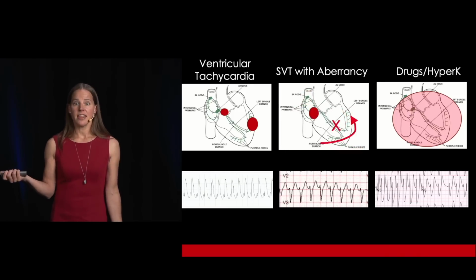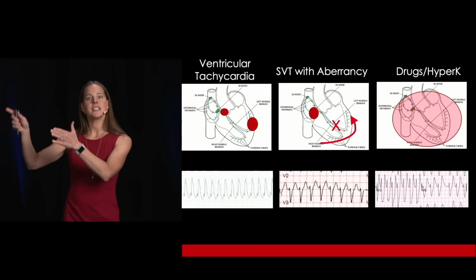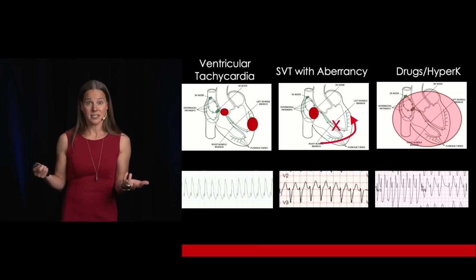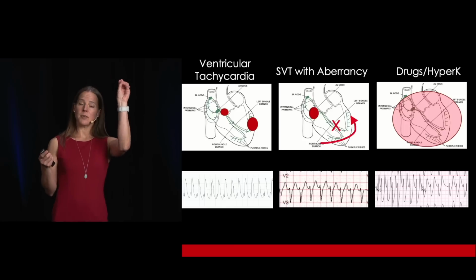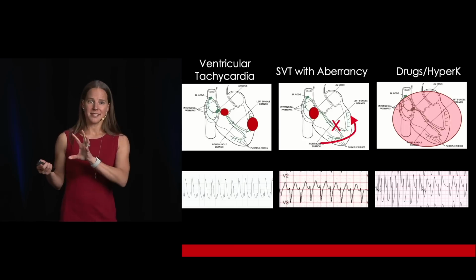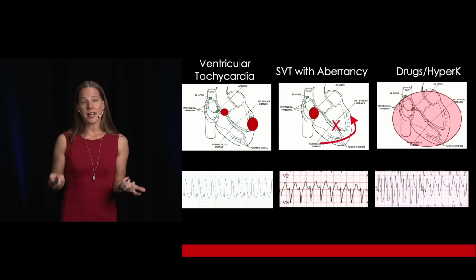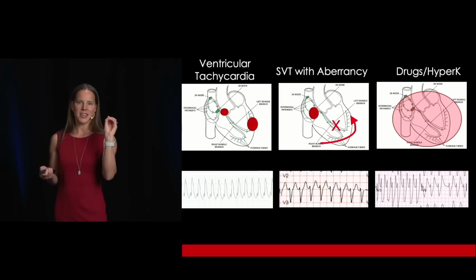Let's say that your left bundle branch is out, and so then your right bundle branch is taking all of the conduction. And remember, ventricle conduction is slow and inefficient, and so even though the tachyarrhythmia is coming from the atria, it is wide. So that's what you have in an SVT with aberrancy. So wide complex tachycardia, but the tachycardia is coming from the atria.